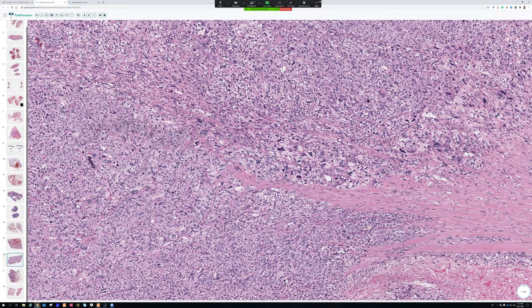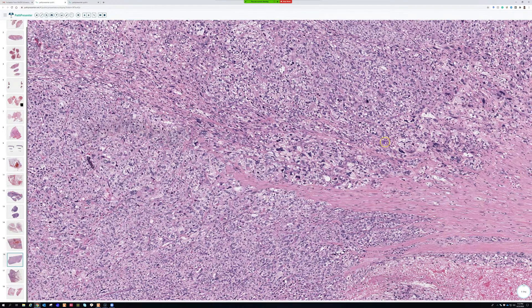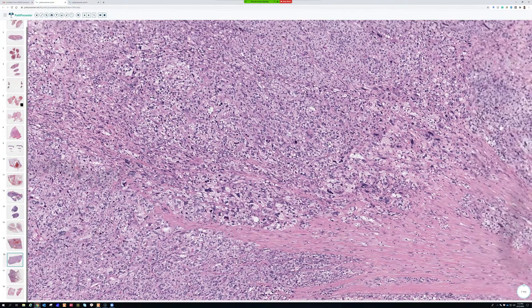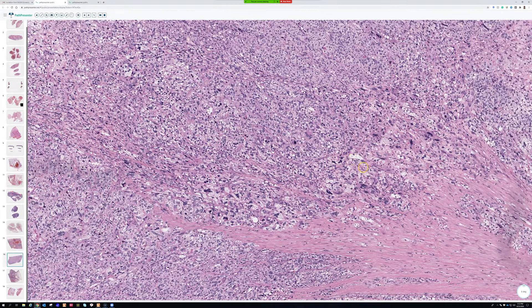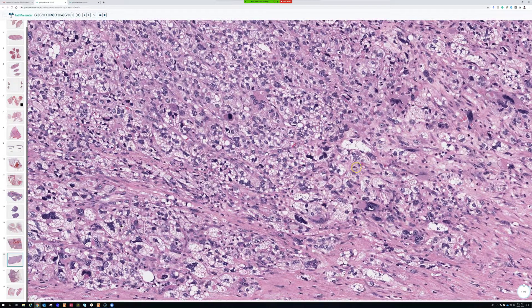If you don't have a pleomorphic lipoblast, what you're left with is high-grade sarcoma, basically UPS. The thing that makes it recognizable as liposarcoma is the presence of pleomorphic lipoblasts. Other liposarcomas can have lipoblasts — you can watch the full liposarcoma video for more — but the one that must have it to meet diagnostic criteria is pleomorphic liposarcoma.